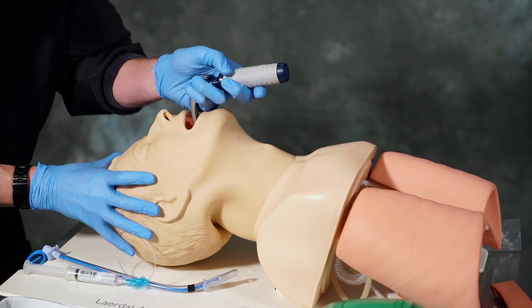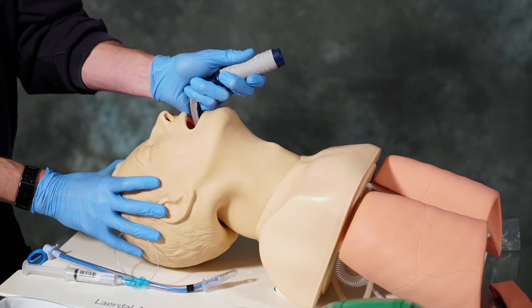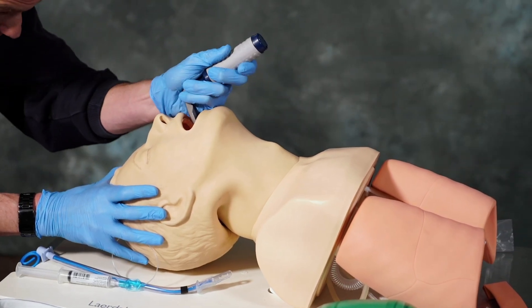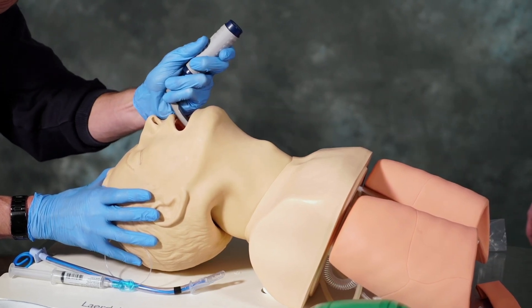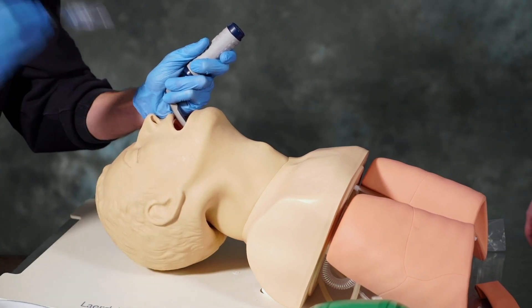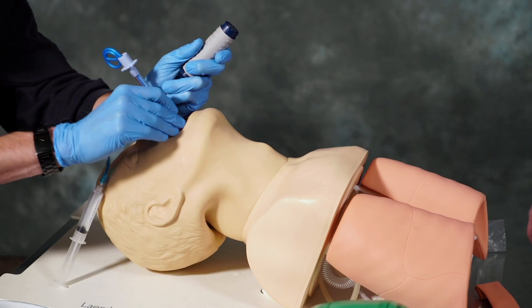Once we have the patient's head positioned properly, we're going to insert the laryngoscope blade on the right side of the patient's mouth and sweep left, trying to push the tongue out of the way in order to get a good visualization of the vocal cords. Once we visualize the vocal cords, we then take our ET tube, insert it, and physically watch it pass through the vocal cords.